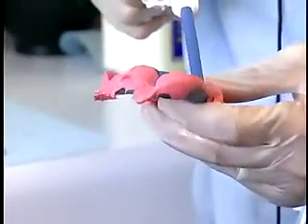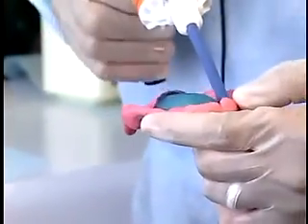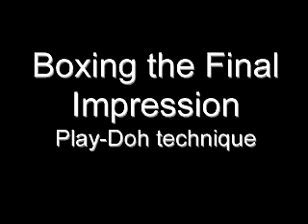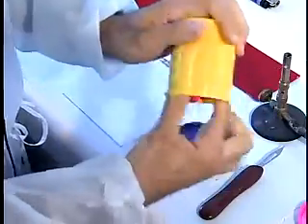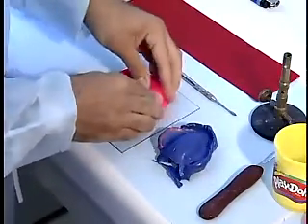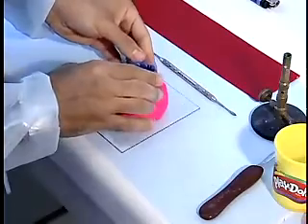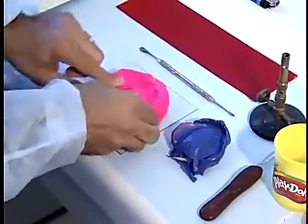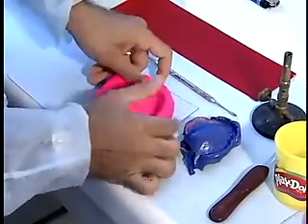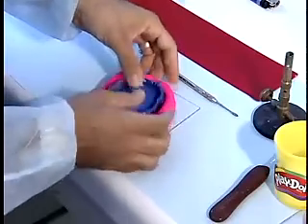The final impression is completed with light body polyether impression material. Follow the same steps as for rubber base. Place a ball of Play-Doh on a flat surface. Create a concavity in the Play-Doh to accommodate the final impression. Place the final impression into this concavity.